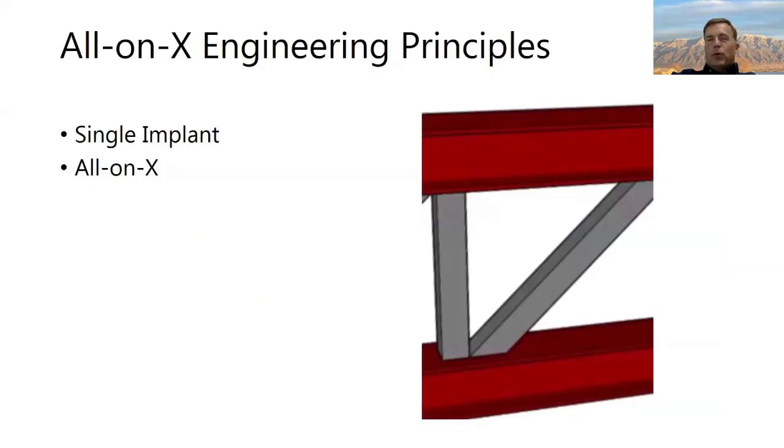This is more of a trivial pursuits type slide. I don't know about you guys, but I always thought, if I'm planning a single tooth implant, I always try to plan it so the occlusal forces with the arc of closure are going to be right down the middle of the implant. And then all of a sudden, those rules seem to go out the window. Why is that?